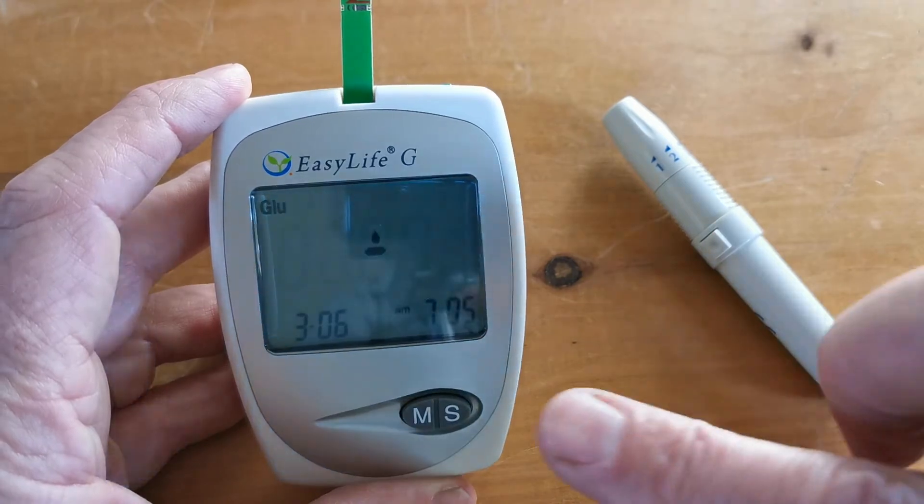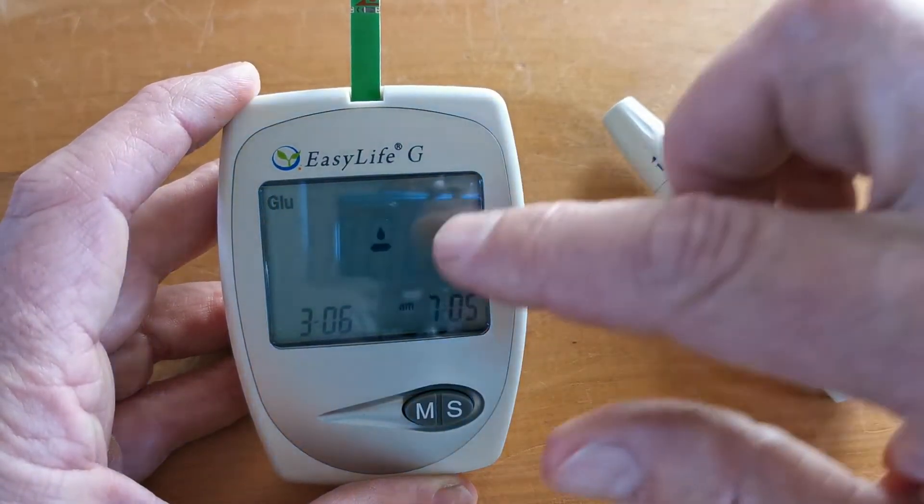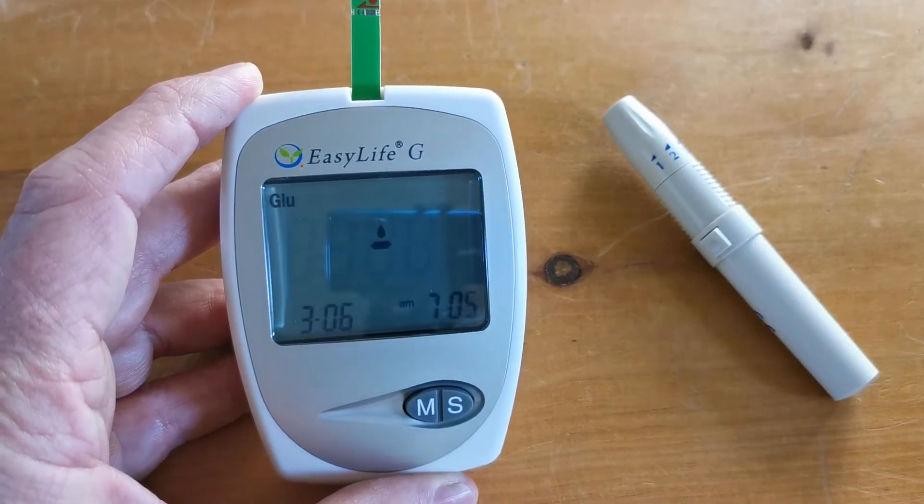The next thing you will see is the meter indicating that the test strip has been accepted and is valid and ready for use, shown by a flashing icon suggesting that you add a blood sample to the test strip.